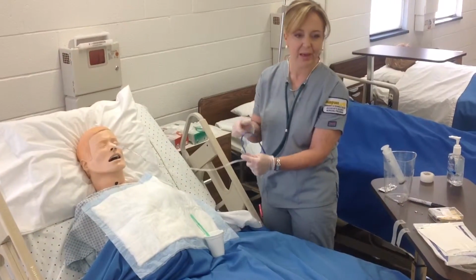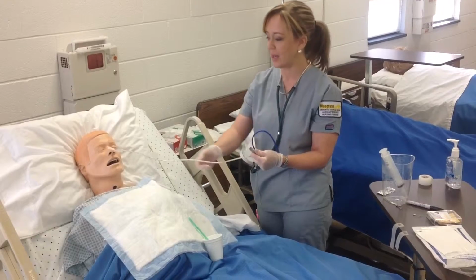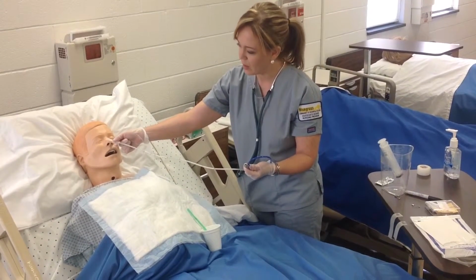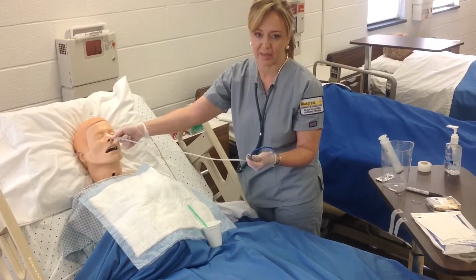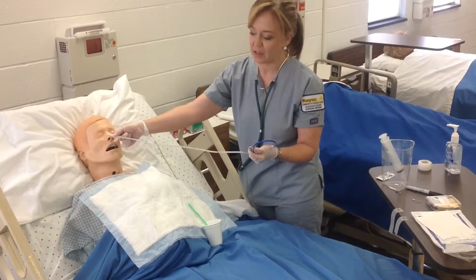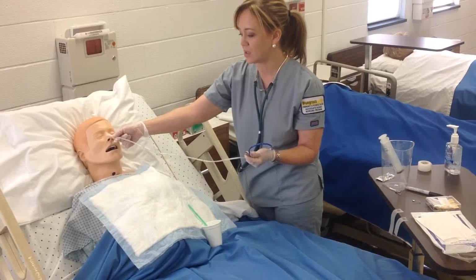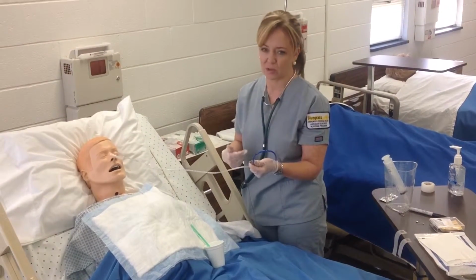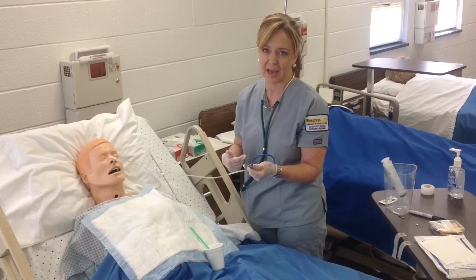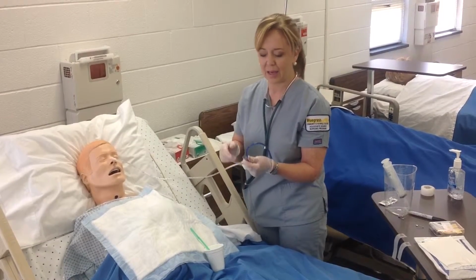So then I want to measure the tube from the tip here to the end so we can document that. You never would reposition a tube in a patient because if they have a surgical incision, it could cause that to reopen.